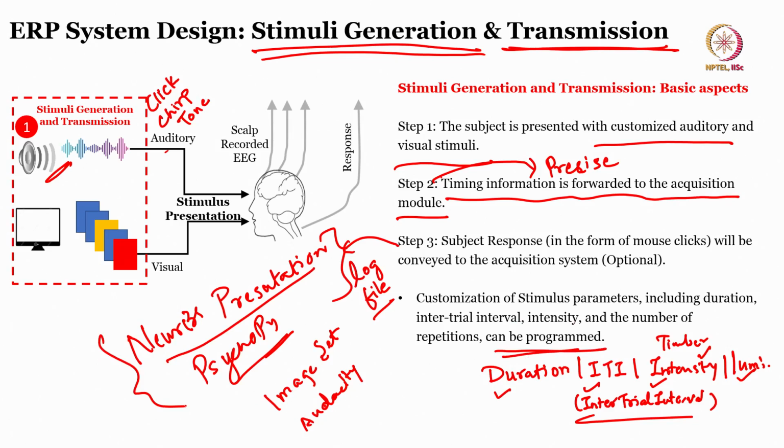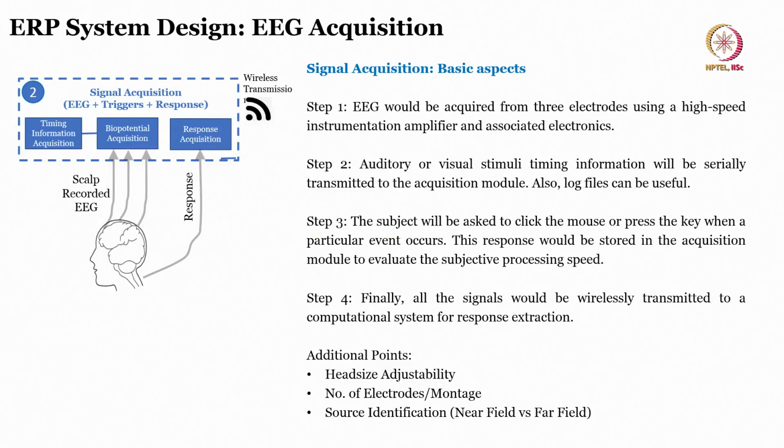So briefly, the important aspect is that stimuli generation can be done using several softwares. You can instantiate whichever amount of images and sounds you want. Also you can program it, configure it, and customize it as per your application. Let's move ahead with the next sub module.